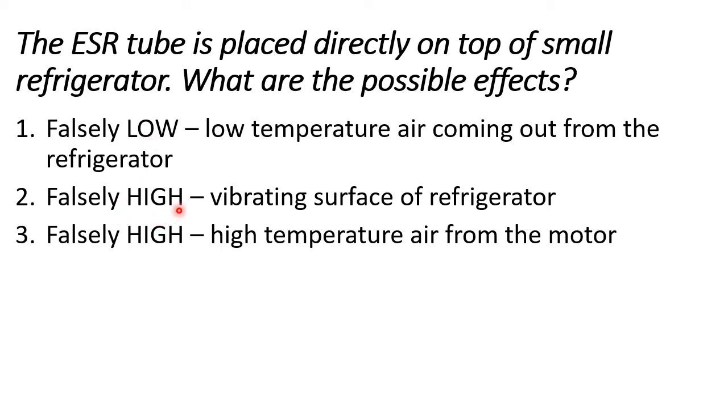Falsely high, pwede din, in cases na vibrating yung surface ng refrigerator. Di ba may mga ganong type of refrigerator, medyo intense yung vibration sa taas or dun sa machinery niya. And pwede rin na high temperature, lalo na kung ang ESR tube mo nasa malapit dun sa rear side of the refrigerator or malapit dun sa motor, dun sa likod.